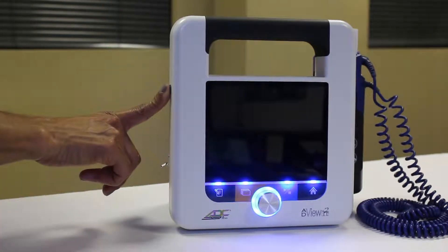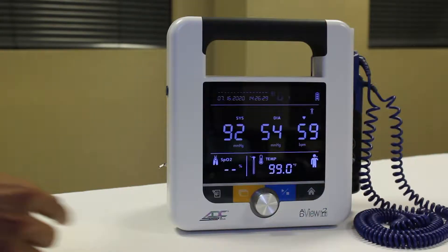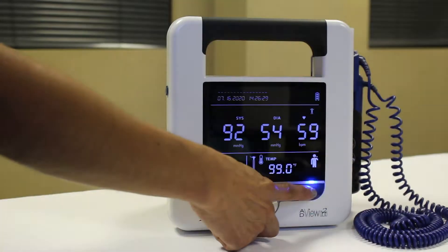If needed, turn the device on by pressing the power button on the left side. If on, wake the unit up by pressing the home button.